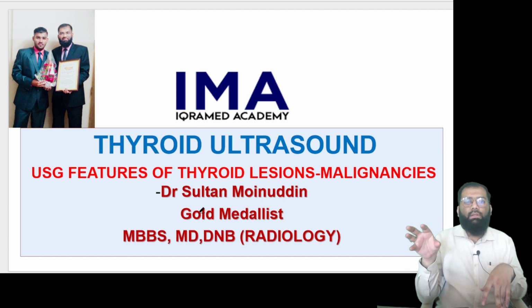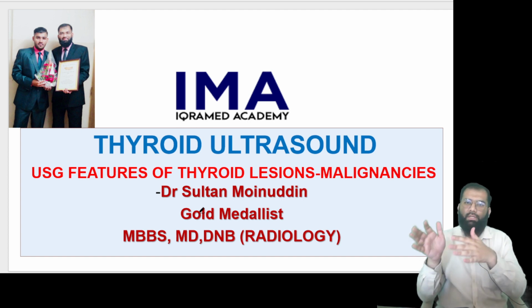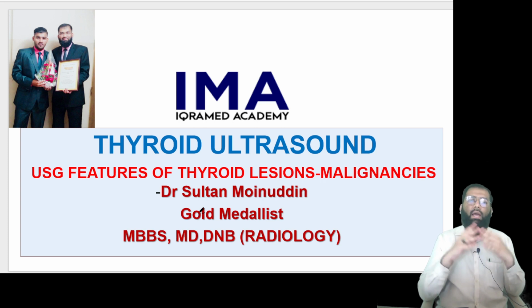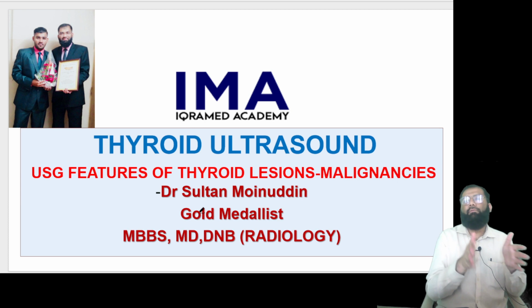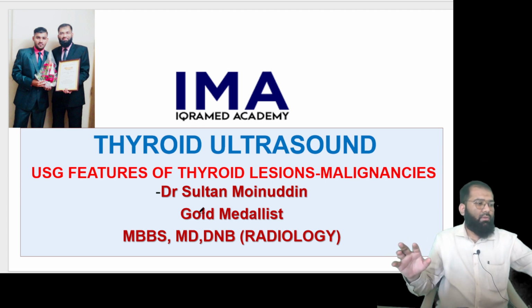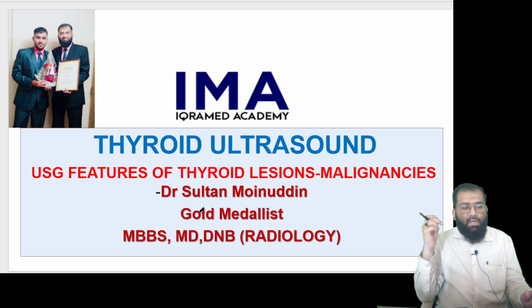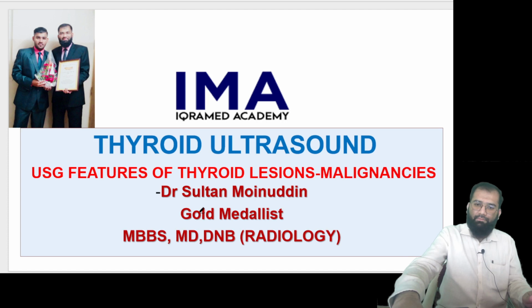The main purpose is to understand how a follicular CA looks on ultrasound and how a papillary CA looks on ultrasound. Also, we will discuss how the metastasis in follicular CA is different from metastasis in papillary CA. The major differences between the two would be talked about in this session. So without any delay, let us begin.